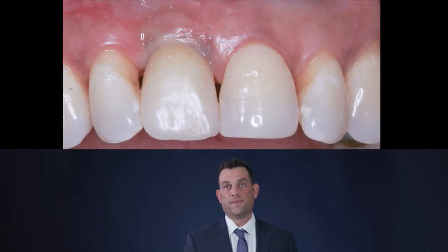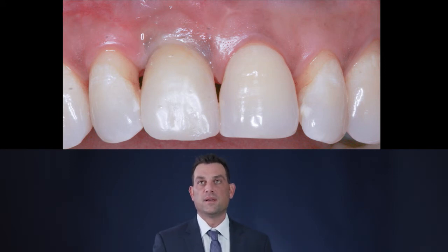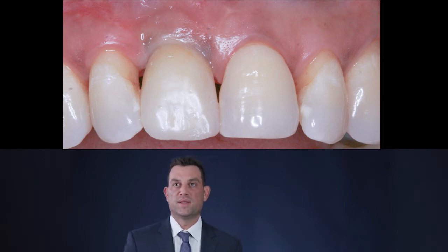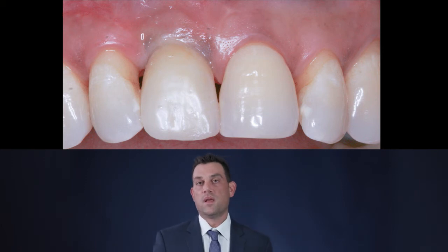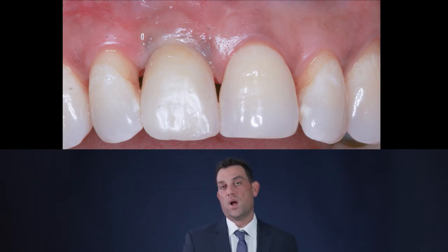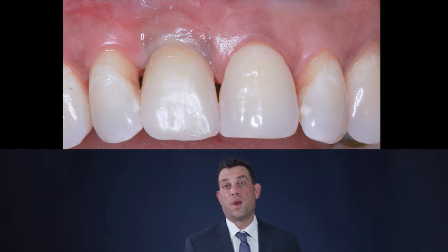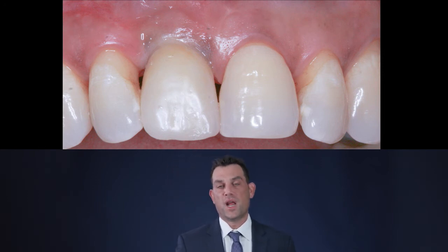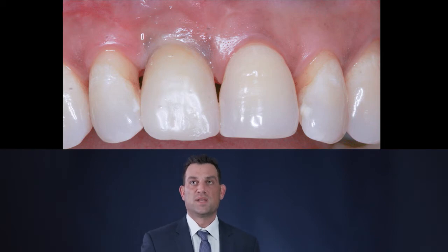This is the delivery of that immediate temporary crown. And as you can see, there's still some blanching, and we have some open spaces, some black triangles between our teeth, which is another very important point in terms of patient expectations. We did pretty well in this case, as this patient suffers from a history of moderate horizontal periodontal bone loss. But if you were to take a look at the preoperative pictures, you'd see this is a significant improvement, and we're starting to mimic nature.